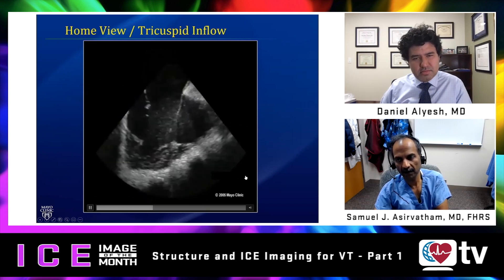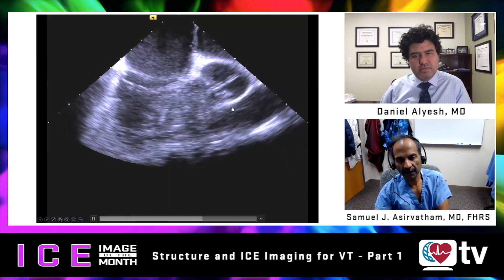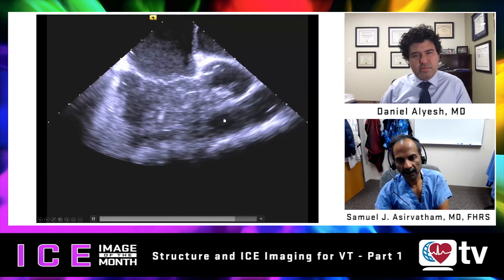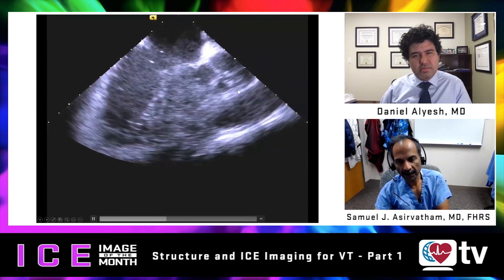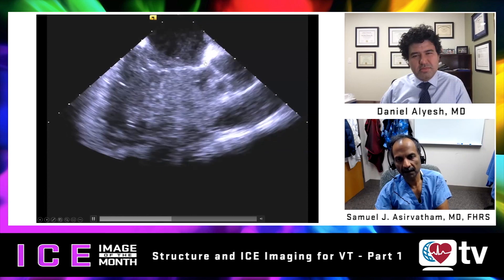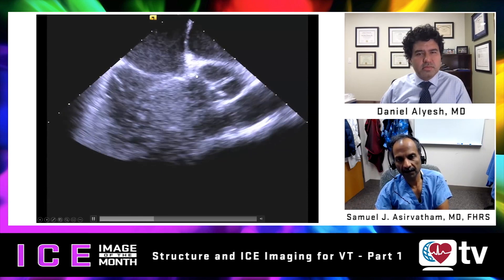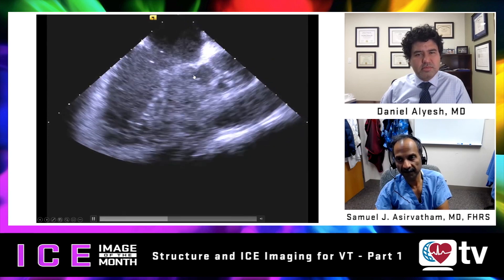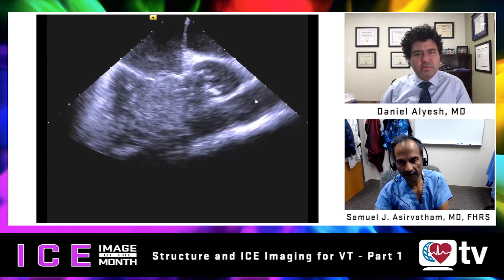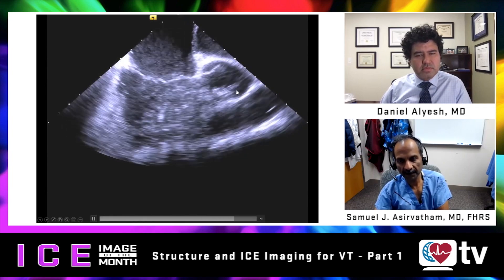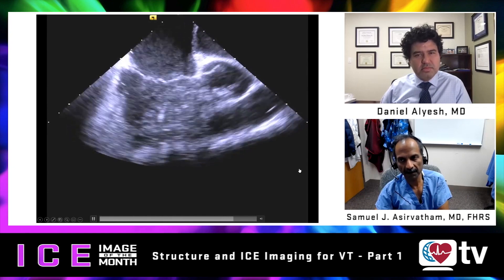Opening the view further, we see the inflow and bridging into that site is the aortic valve annulus. The aortic annulus-to-inflow relationship is relevant for parahisian ventricular tachycardias, and its relationship to the outflow is relevant for sinus of Valsalva tachycardia and posterior RVOT tachycardias.